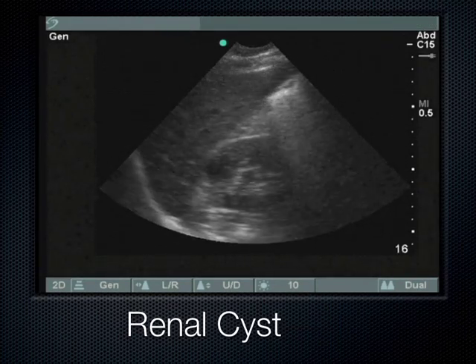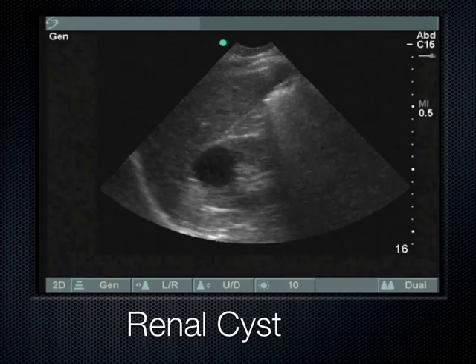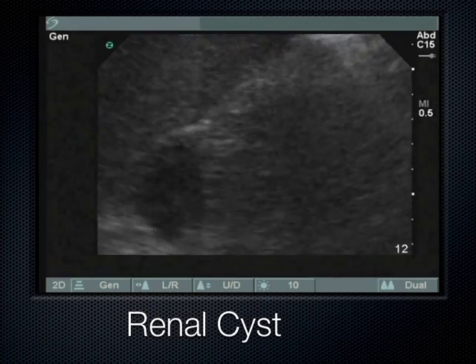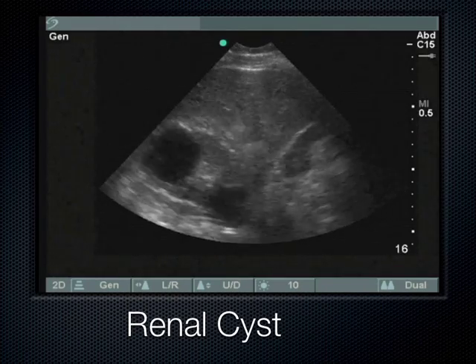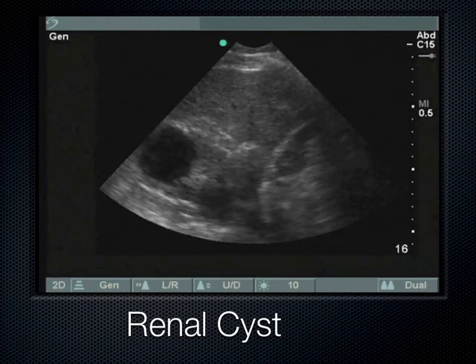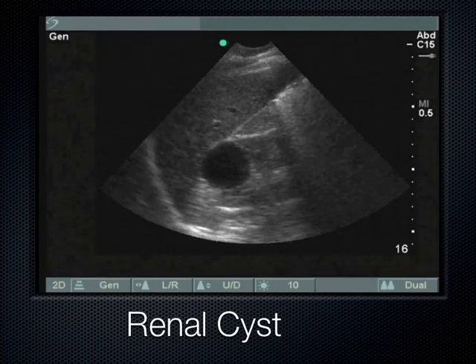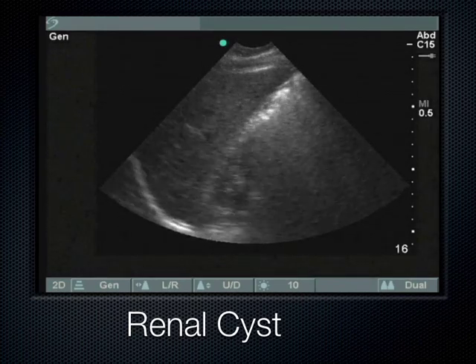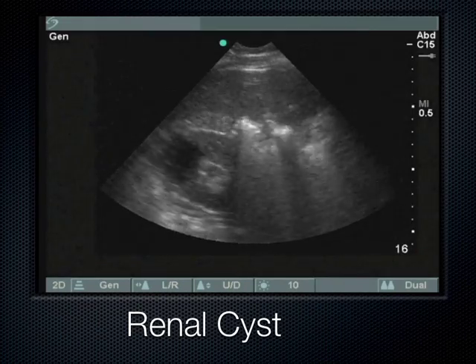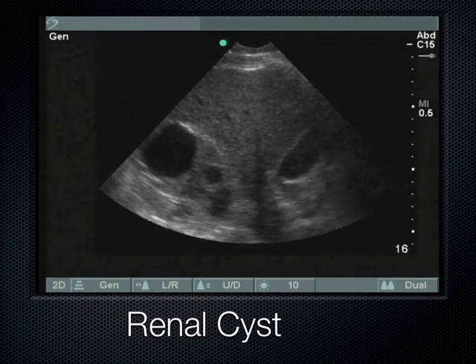This is an example here of a renal cyst. Notice that it's out in the cortex of the kidney. This is the liver. This is the kidney. We're losing the lower pole from all this bowel gas. But as we get out, we can actually see a cyst up here, and then there's another little cyst down here. Here's that cyst towards the upper pole over here. And no matter how you rotate the probe, from transverse to coronally, the cyst is always spherical and anechoic in all planes.